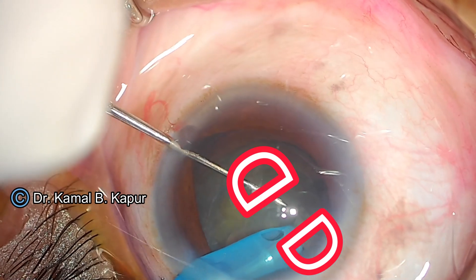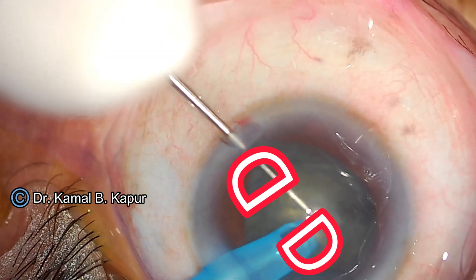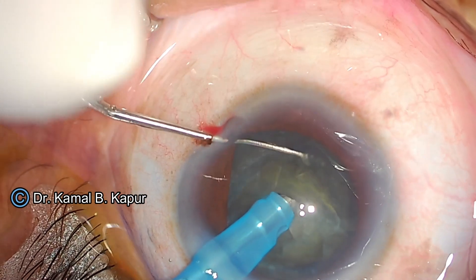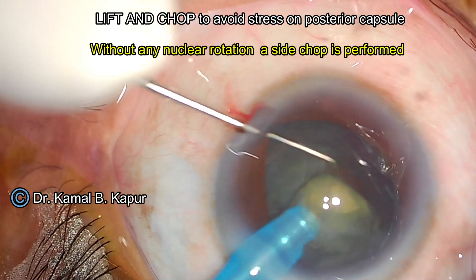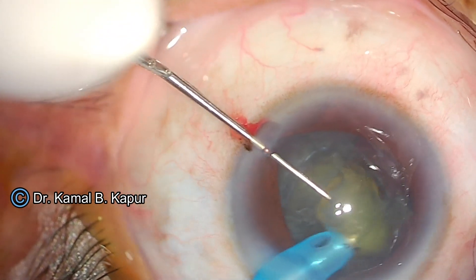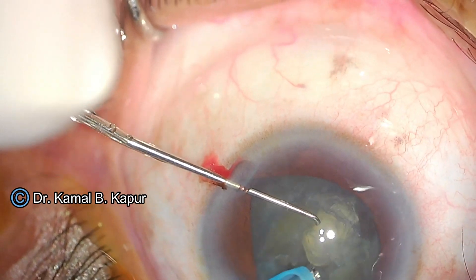We chop the cataract into two D segments. Again, we try as much as possible not to rotate the two D segments. You will notice that I rotated the phaco tip at one angle and without rotation of the nucleus segment, I did a side chop and removed one part of the D segment very, very slowly and carefully.